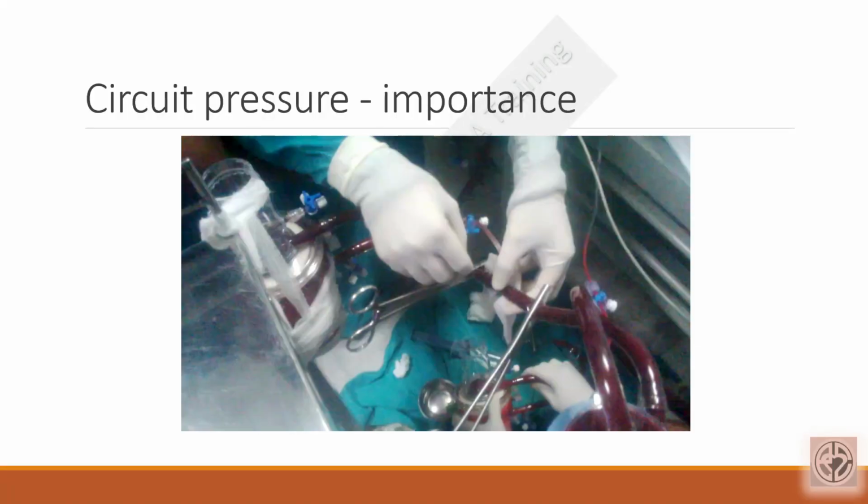But the oxygenator was primed with saline, not with blood, and it is a new oxygenator. Again, there will be some kind of new surface reaction. The patient develops some kind of hypotension. You can see the pressure has come down to 65/36. That's the pressure which dropped when we changed the oxygenator. This is expected, especially with a crystalloid prime rather than a blood prime. And again there's a new circuit, so there's a new surface reaction.